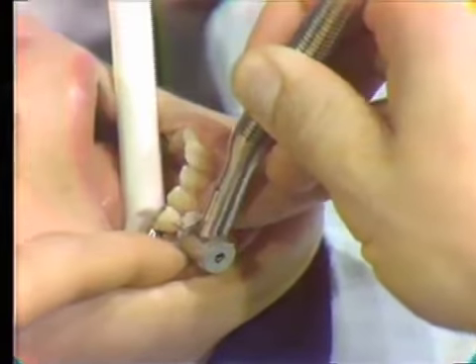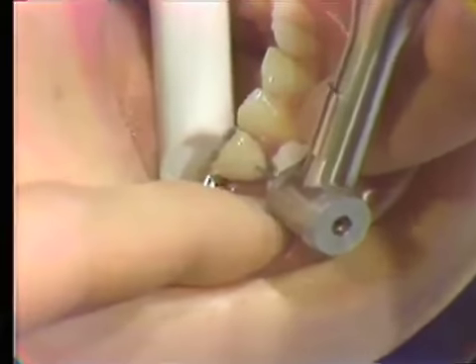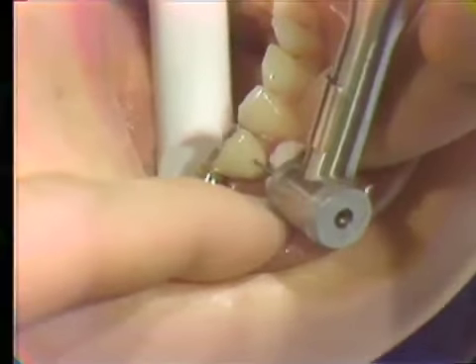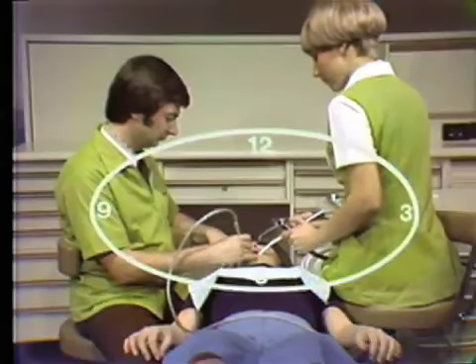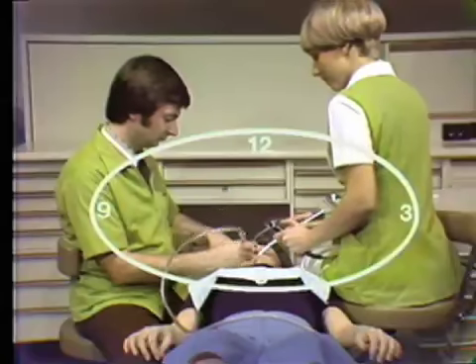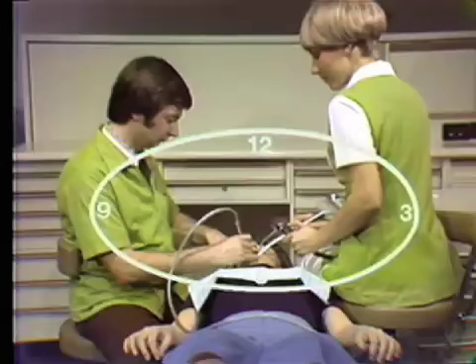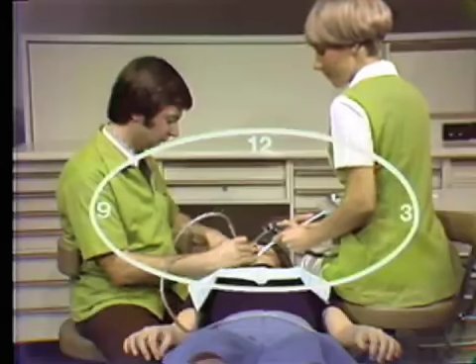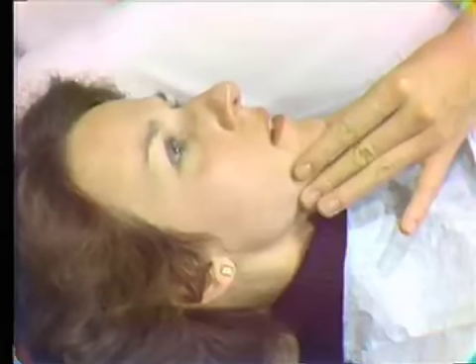The buccal approach to the mandibular right posterior segment can be accomplished using direct vision. The operator has comfortable access to this area from the 9 o'clock position. The patient's chair is lowered as far as possible, and the chair back is raised until the patient's oral cavity is at the elbow height of the operator. The patient's head is turned slightly toward the dental assistant.